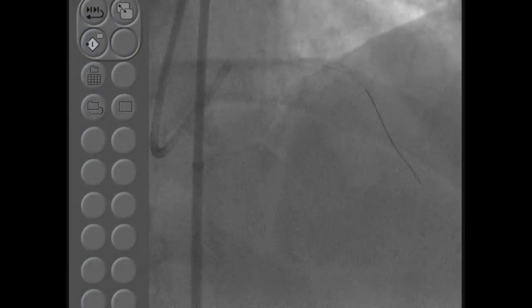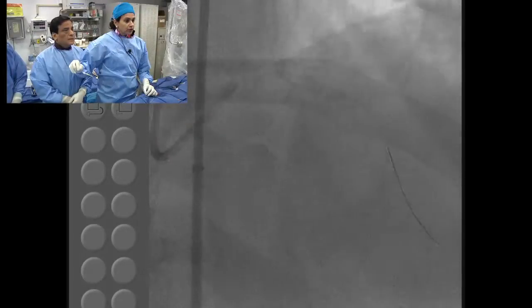Anu, how is the progress with your CTO? We are just starting here. We have the Fielder FC. It's a regular Fielder, yeah.